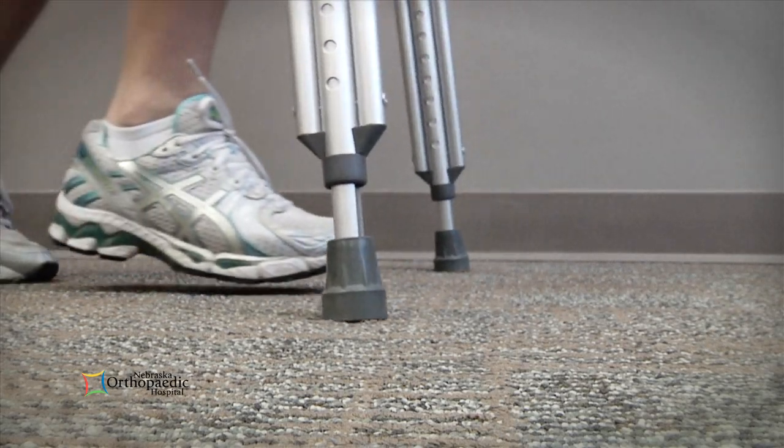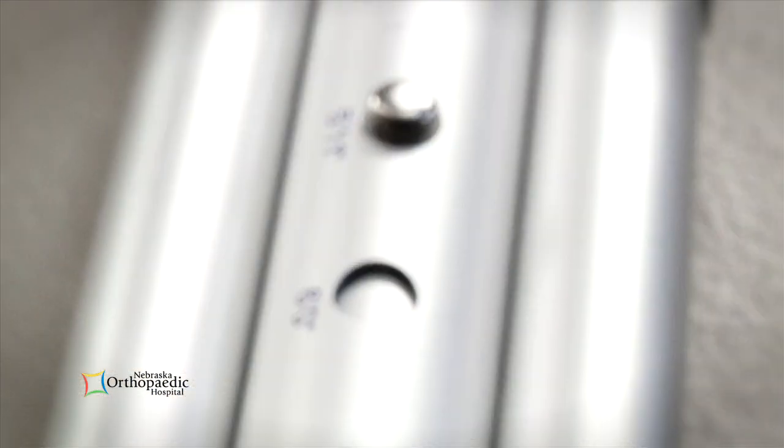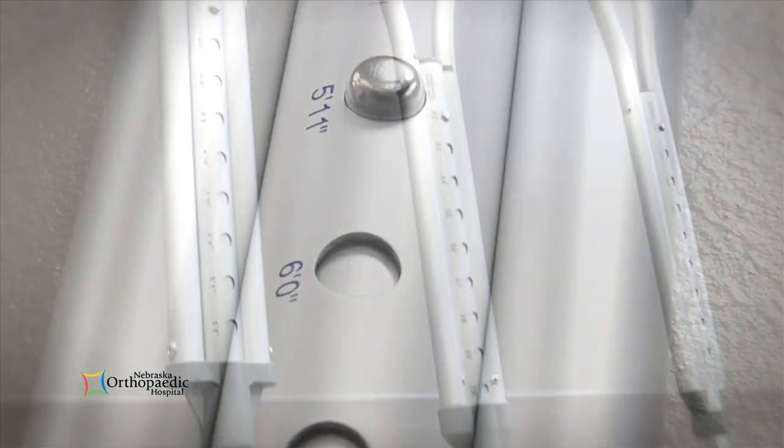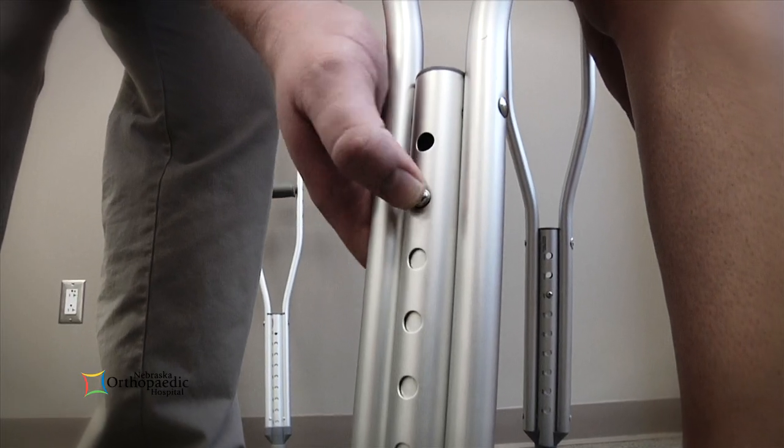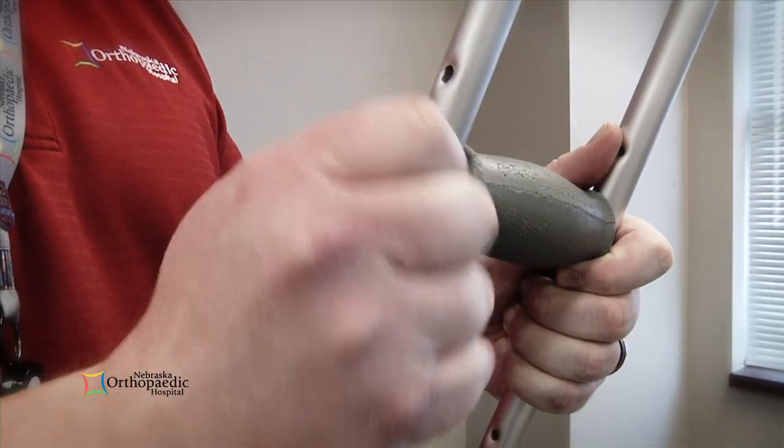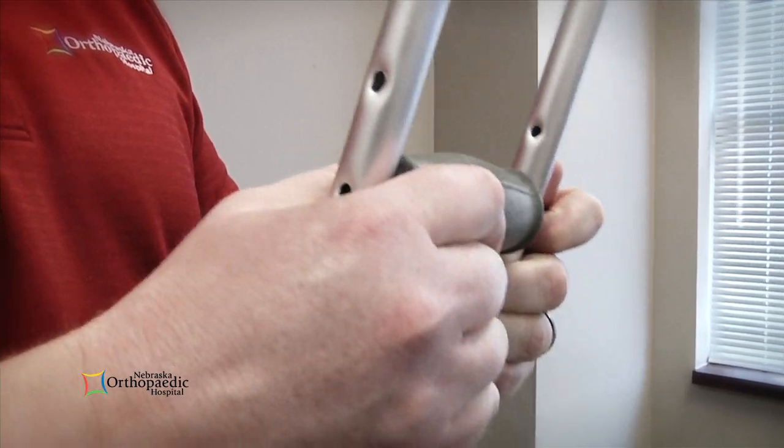Before practicing the use of crutches, it is important that they are fit for you specifically, as crutches come in a variety of sizes. If you have a set of crutches or are borrowing from someone, verify the height range and adjust accordingly.